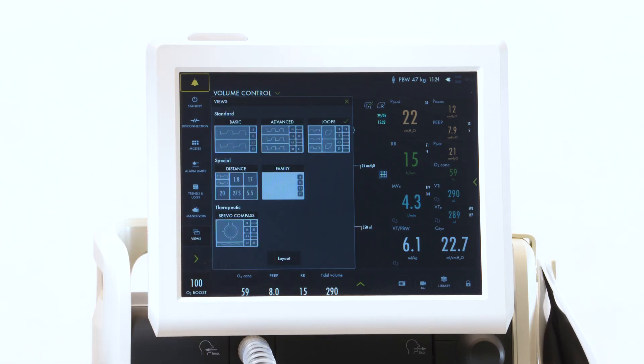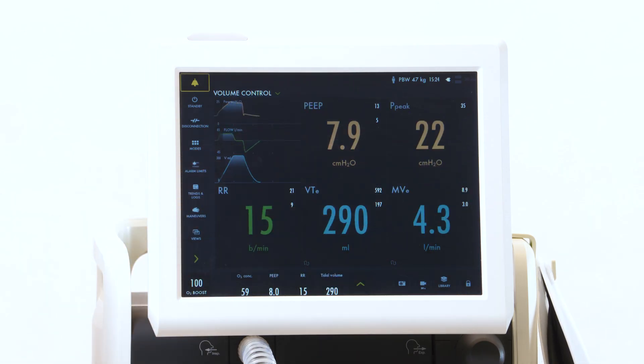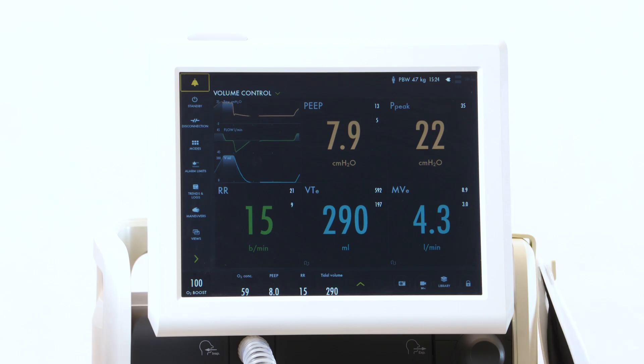When you look at your views again, there's a distance view. It will show you five basic measured values, as well as your pressure and flow waveforms.